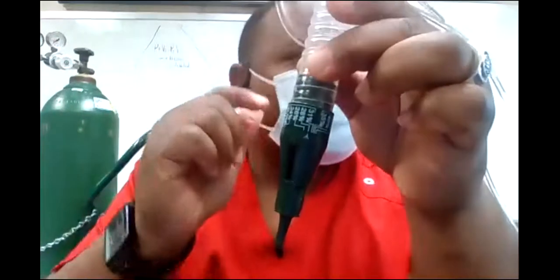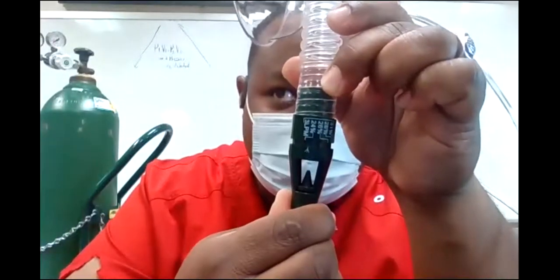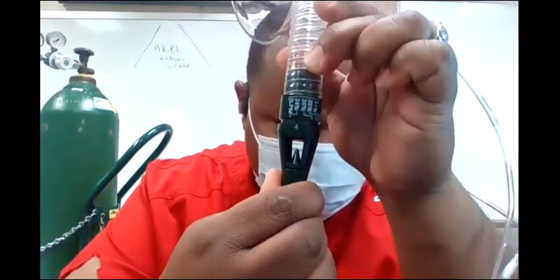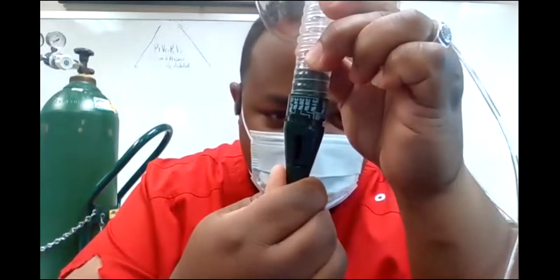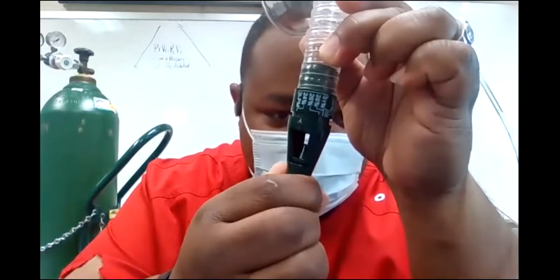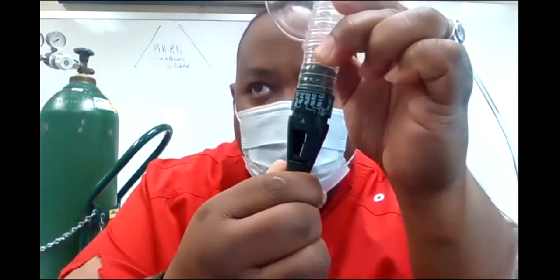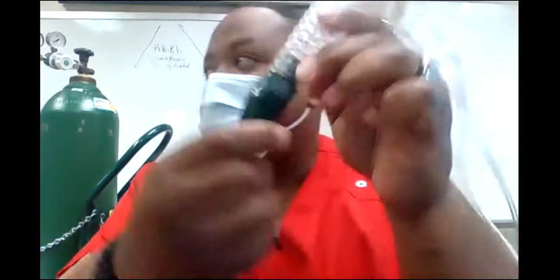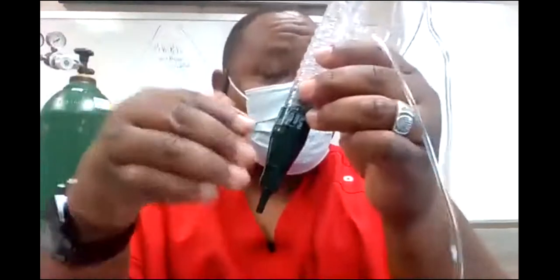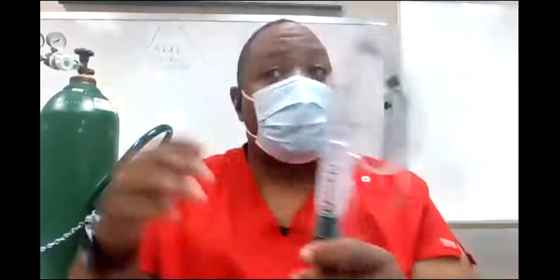But notice what's happening. Look at this window down here. As I open it this way, look how big that window gets. You see my window? Look at the screen. And then I can close that window, right? Notice the more I open the window, the less the FiO2. The more I close the window, the higher the FiO2 goes. Open the window, FiO2 is going down. Close the window, FiO2 is going up. This is the Venturi Principle: air entrainment. The more open the window is, the more outside air comes in, and the more closed the window is, the less outside air can come in.